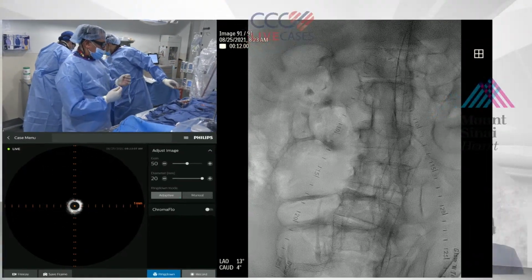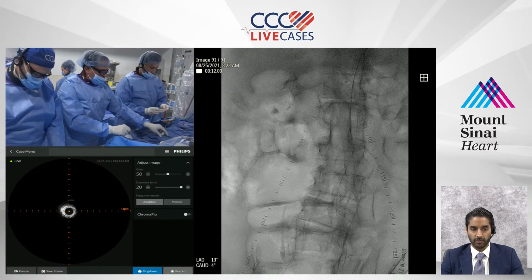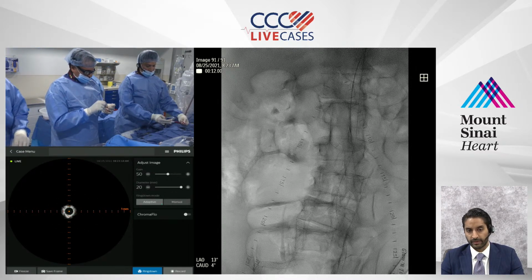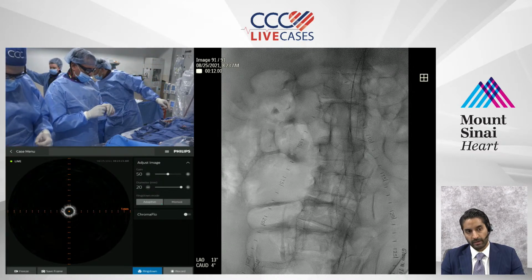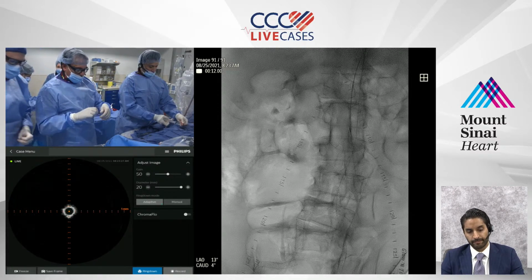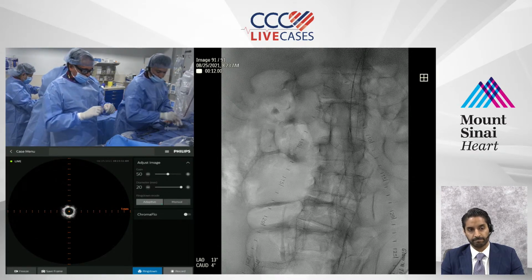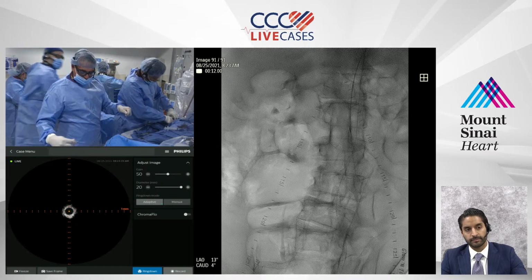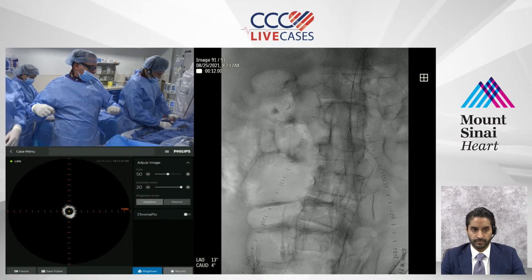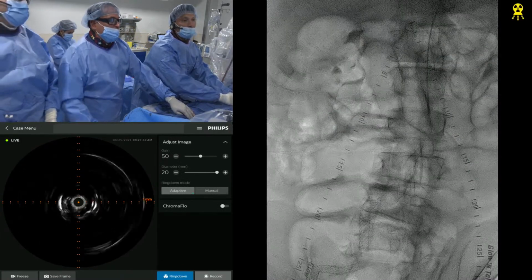Yeah, this would prove to be a very interesting bifurcation stenting if you do. I like the idea of just using a balloon protection of the right ostia to help nail the ostium of the left. Yeah. ACT. Do you also have a plan of IVUSing the ostium of the right? The interesting thing is when Luke and I did it last time, we ensured that there was no gradient, and we were able to get rid of the gradient. We double-checked it before and after. We did not IVUS at that time. So I think that the angle of the contralateral may actually help us because we know that there's no stuff there.